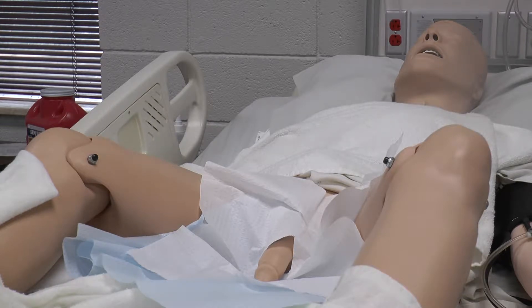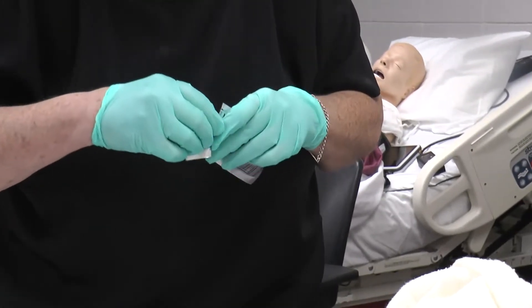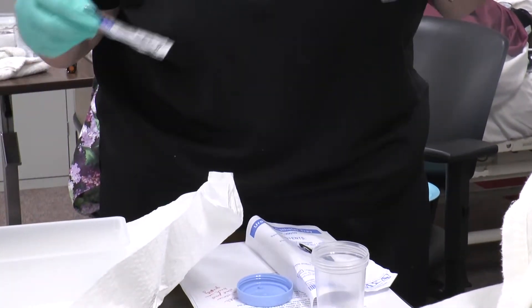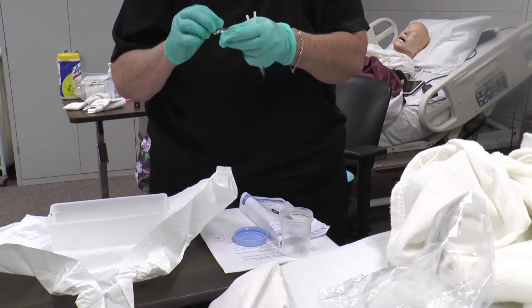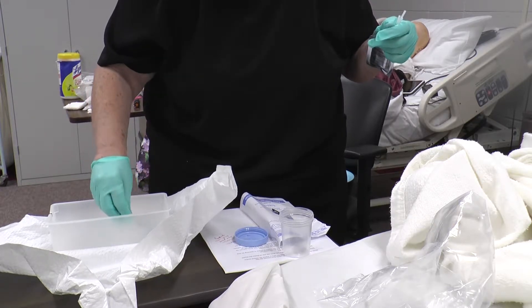If we're getting a specimen, set the container over here without touching the top. Open up the betadine swab packets — one, two, three. Still sterile, take the catheter out without touching the inside and set it aside. Find the notch on the gel packet and insert the gel into the catheter.